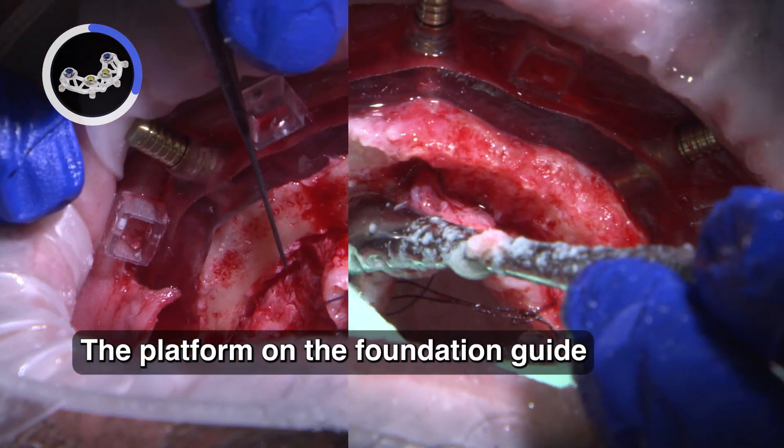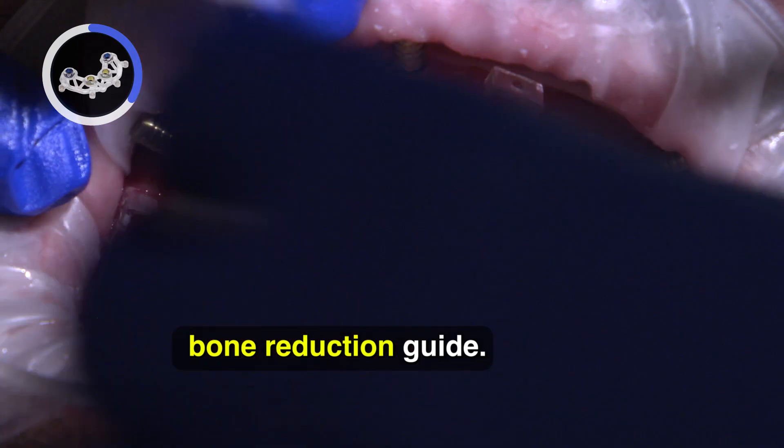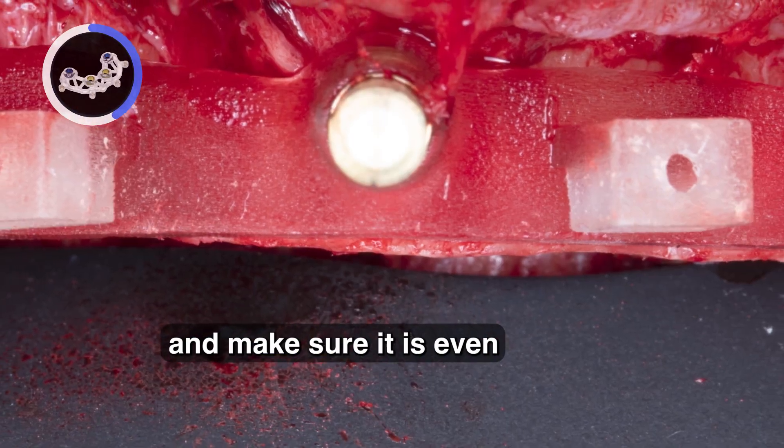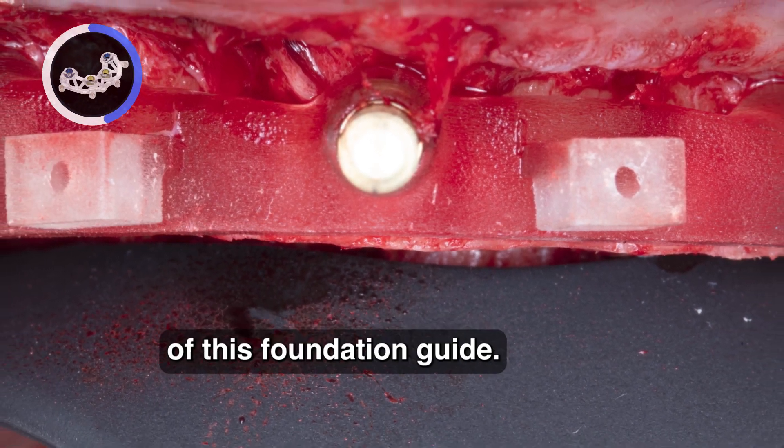The platform of the foundation guide is then utilized as a bone reduction guide. A flat instrument can be used to verify the bone reduction and make sure it is even with the flat surface of the foundation guide.